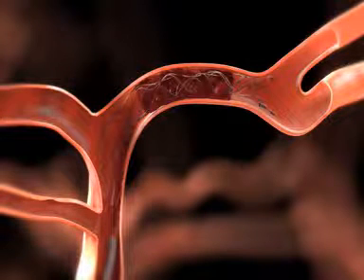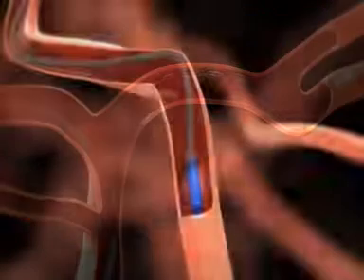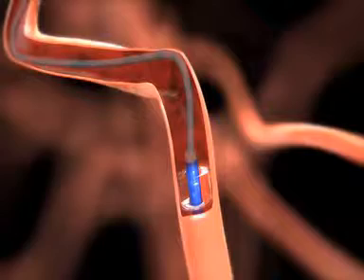Angiographically assess the revascularization status of the treated vessel. Inflate the balloon of the guide catheter to occlude the vessel.